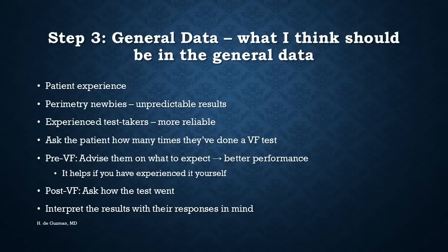Before the visual field, especially before the first time, it would help if you were to advise them on what to expect. This will improve their performance. And the only way you can advise someone what to expect is if you have experienced it yourself, as I said earlier. After the visual field test, ask for feedback, ask how the test went, and interpret the results with their responses in mind.